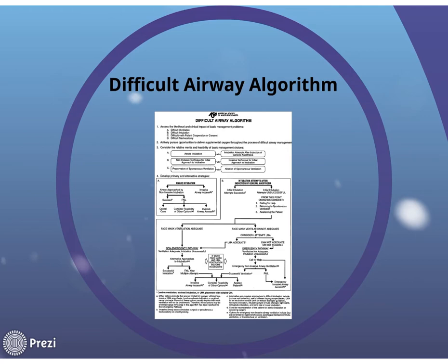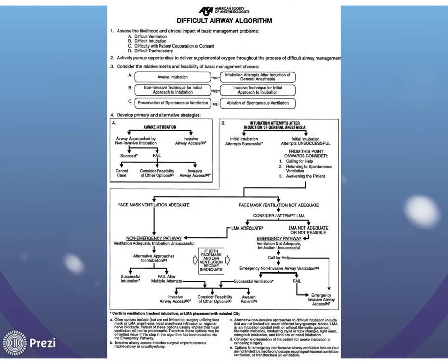That's what's at the bottom here. Not death, but you can't intubate, you can't ventilate. That's when we go to the other emergency techniques, that I have, again, not ever done except in simulation. Pig tracheas are great for that. Put them in the butcher, you can get them. But I would know this: if you see this, then you do this. If you see that, then you do that. Kind of have that in your head, how you're going to go through the system. I don't like the word fail, but it's on there. Okay.